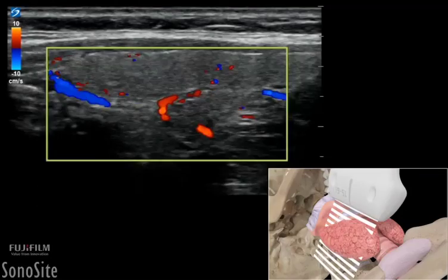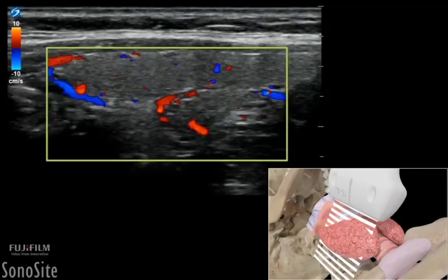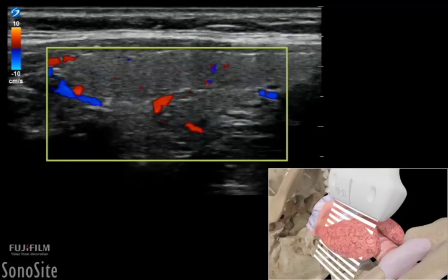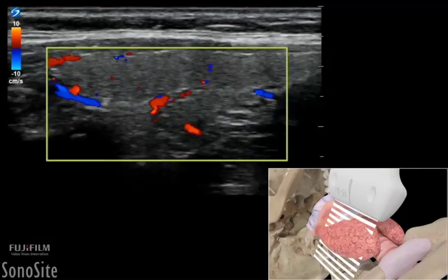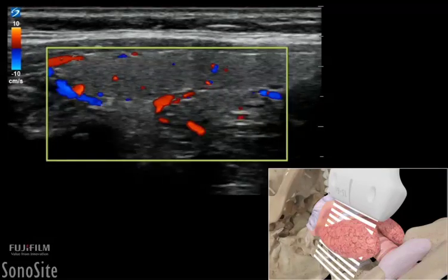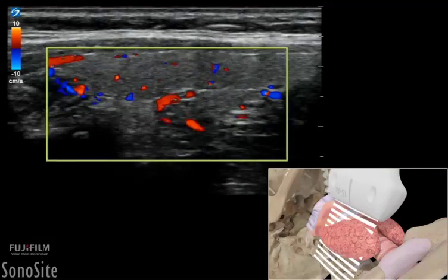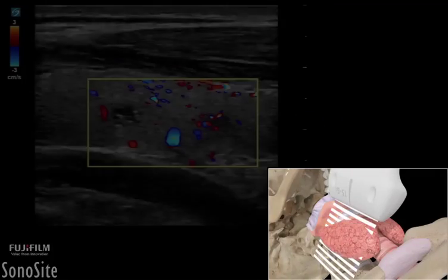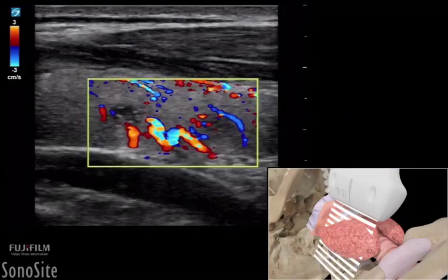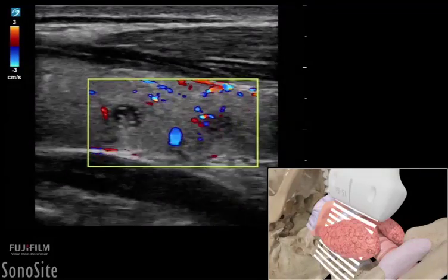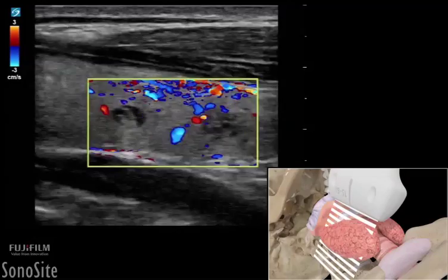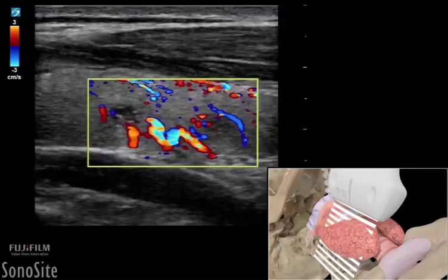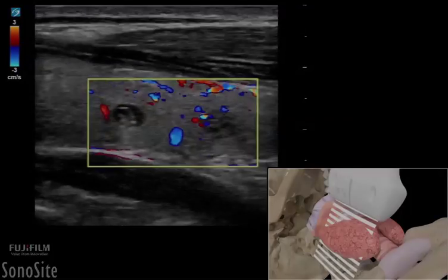The normal thyroid gland is highly vascular and will have profuse blood flow on color Doppler. Color Doppler can be used to evaluate thyroid nodules. A completely avascular nodule is very unlikely to be malignant.